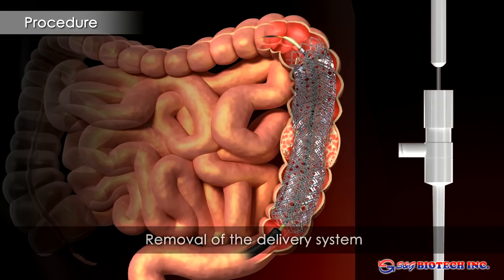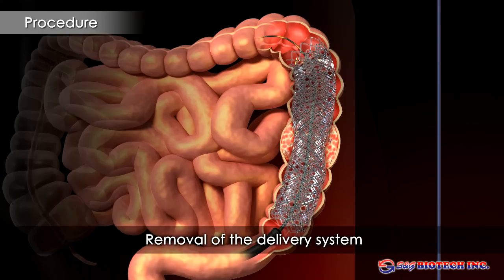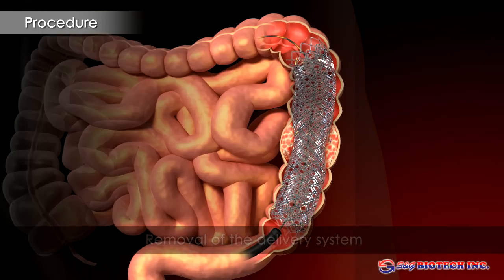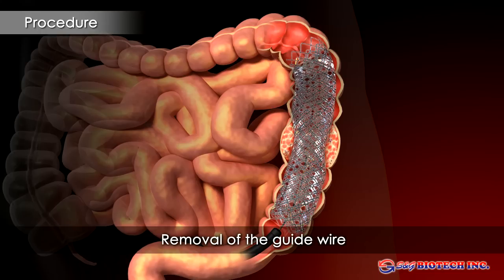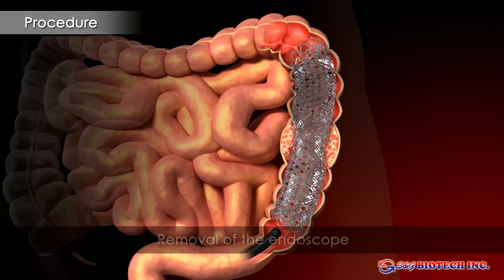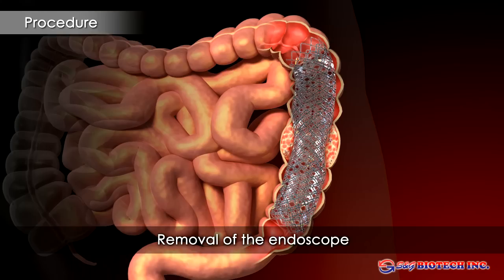Most stents will not expand fully straight away as the shape memory is activated on warming to body temperature. Stents will continue to expand over several days and balloon dilation is not usually required.